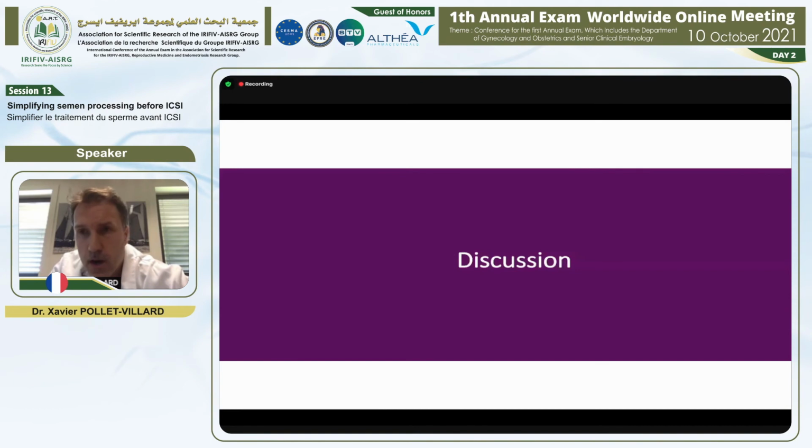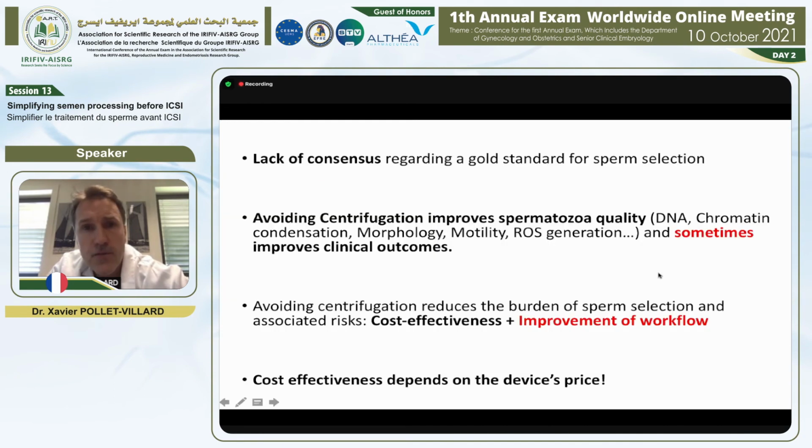So I want now to discuss this small number of studies. First of all, I want to say that there is a lack of consensus regarding a gold standard for sperm selection, but what we can say from all the studies that have been made till now is that avoiding centrifugation improves spermatozoa quality, such as DNA condensation, DNA fragmentation, morphology, motility, ROS generation, mitochondrial membrane potential. And sometimes it can improve clinical outcomes, not always.